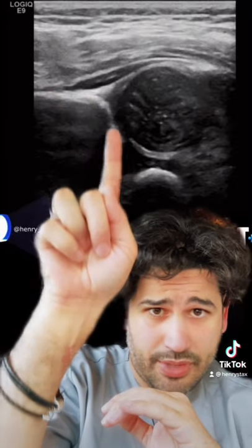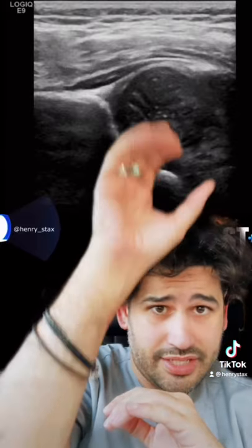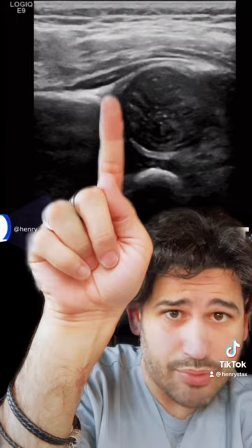Here's your ilium going into the acetabulum right there. This hypoechoic part is the tri-radiate cartilage. Here's your ischium. That's the femoral head — you can see it's a ball. This echogenic portion is your labrum.